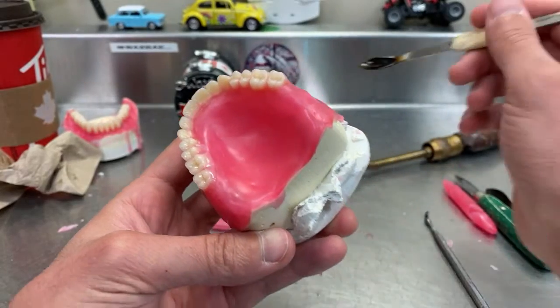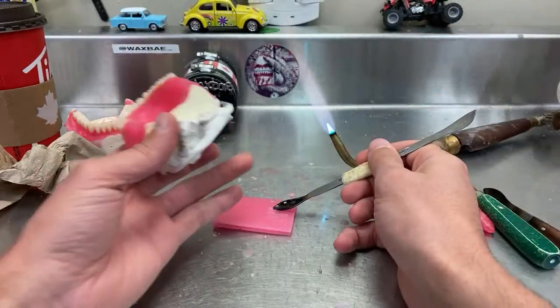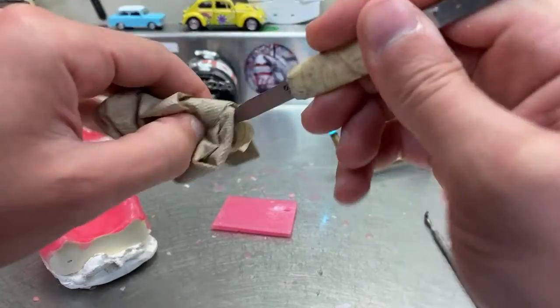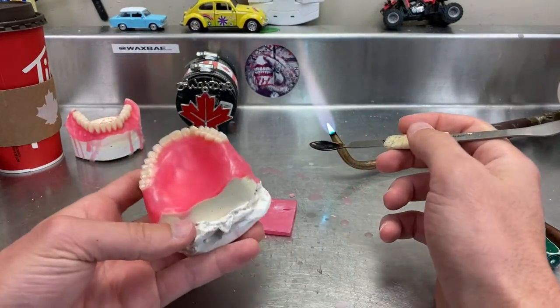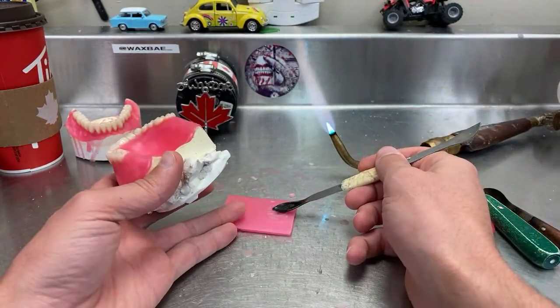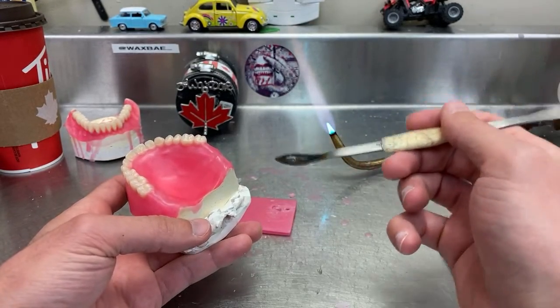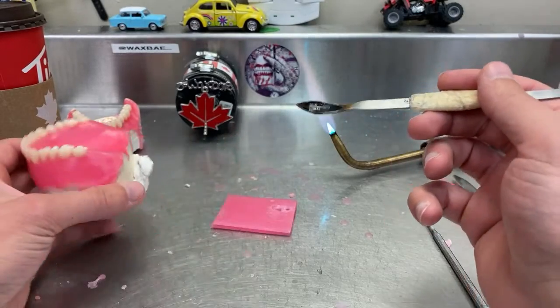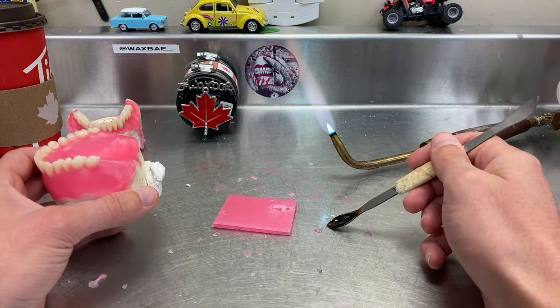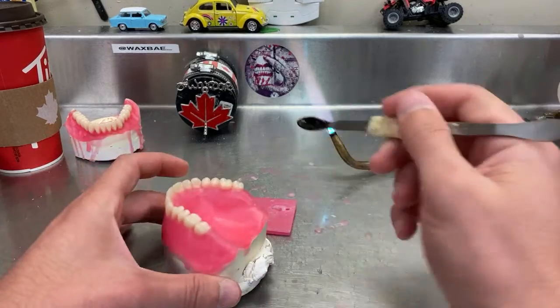And once your wax is hot enough, it will flow once it touches the cold wax. So you don't need to be like, and that's another secret. Once you deal with wax a lot, you'll start to understand its properties and how it actually works with heat and everything. Because you can see if my wax was cold, it will not come out of here. Let's say I have a little bit, and I'm talking to you, and it gets cold, and then when I want to flow it, it does not flow. It will be choppy, and then of course it will be all delaminating and fall apart.